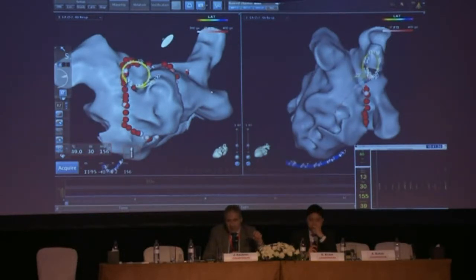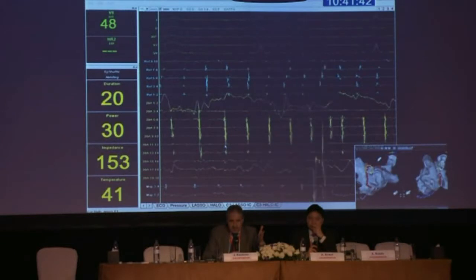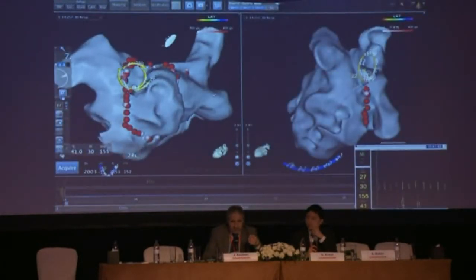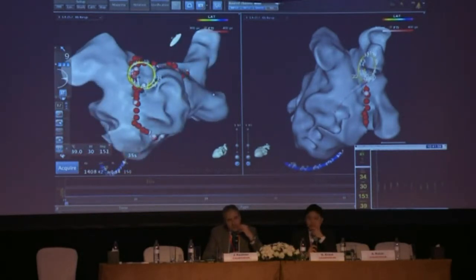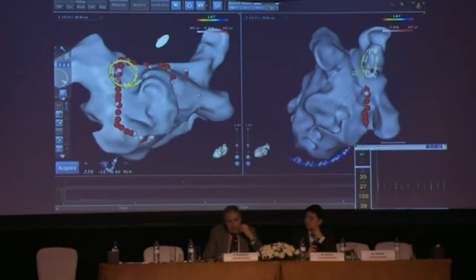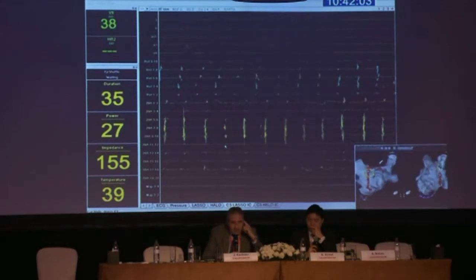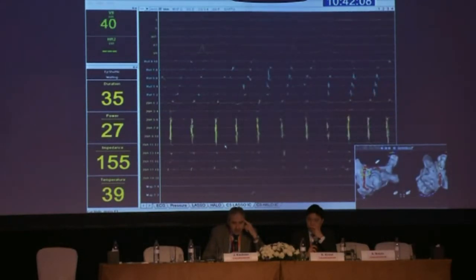And it's a very thick area usually because it's like a triangle, like a pyramid between the superior, inferior vein and appendage, and a lot of epicardial input from that area into the vein. So I think here you have to do it from the venous side, otherwise it's very difficult to get rid of this. We don't see very much of the signals. Maybe if we can enlarge the screen with signals. Yeah. Big signal. That's great.